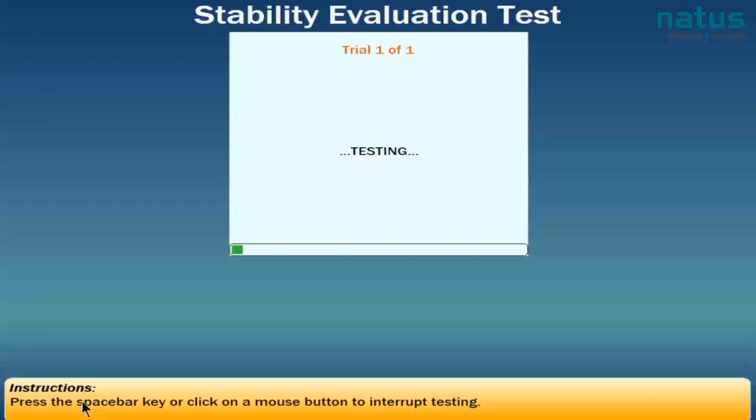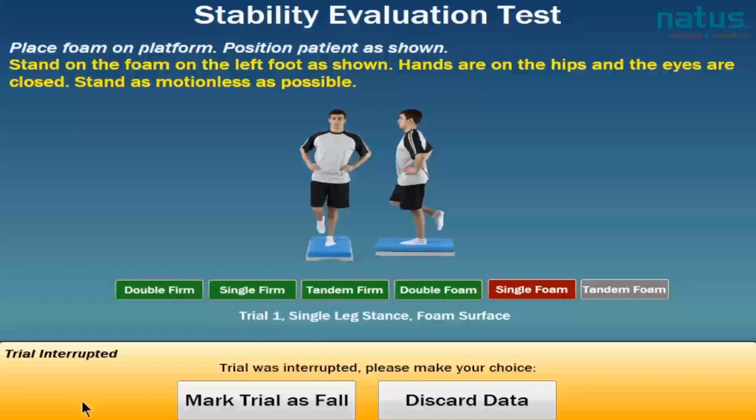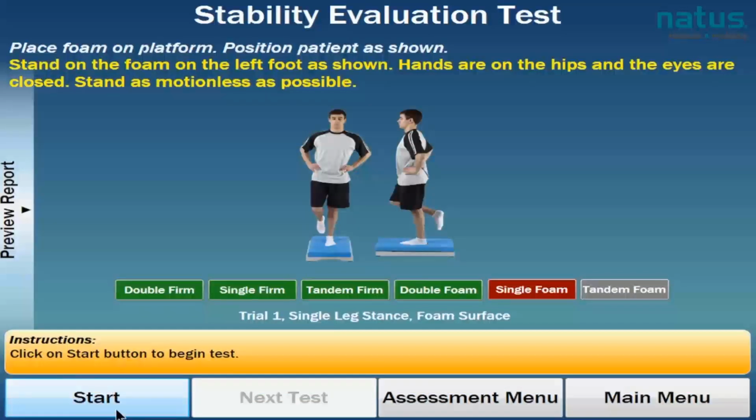When you're ready, close your eyes. His eyes are closed, and you can see that he's unstable, and he opens his eyes and puts his foot down. We're going to try one more time. I want to be sure that you have adequate practice before we collect the data. So for this, I will discard the data, and we will do it again.